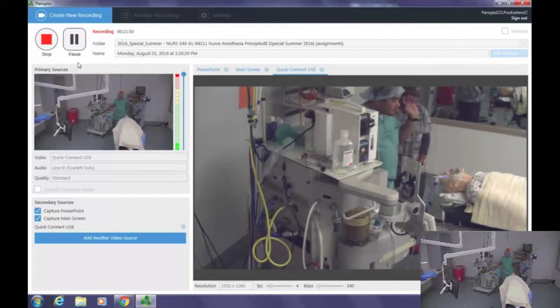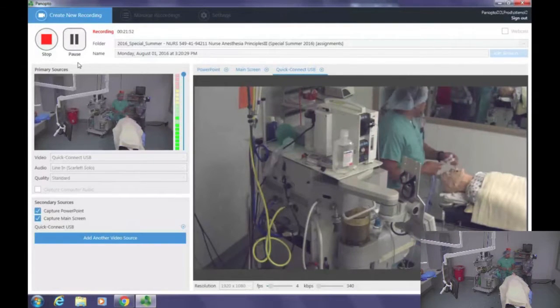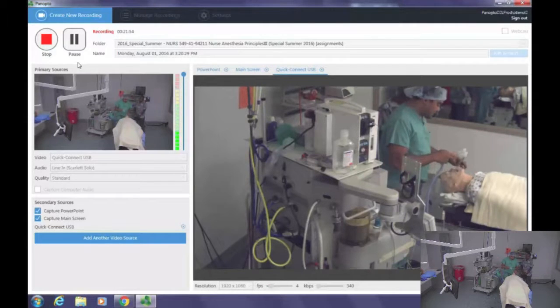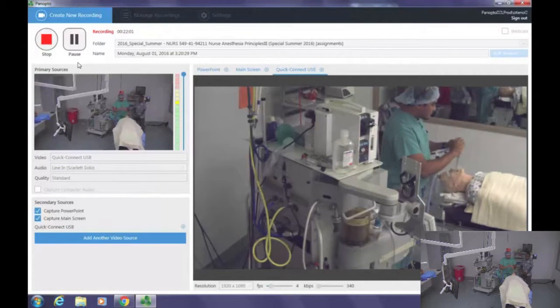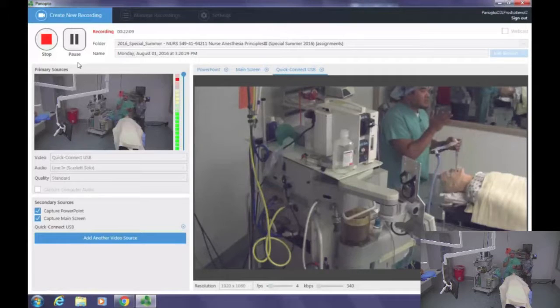Now, for real verification, you would use a fiber optic tube, all right? So what they do basically is insert the fiber optic tube through the tracheal tube and then advance it, and then at the tip, you could actually see the carina, the bifurcation.